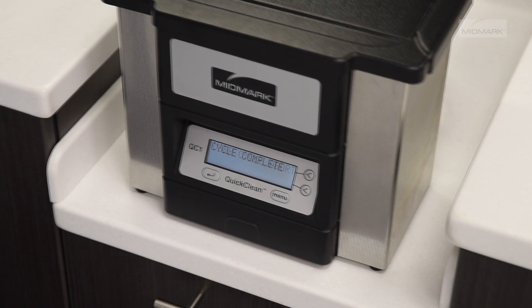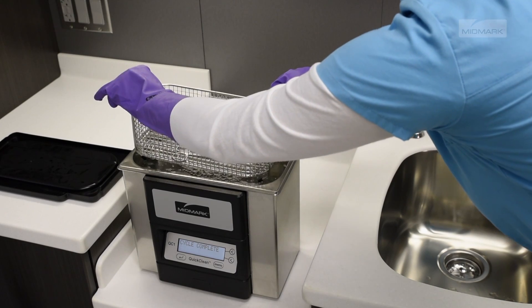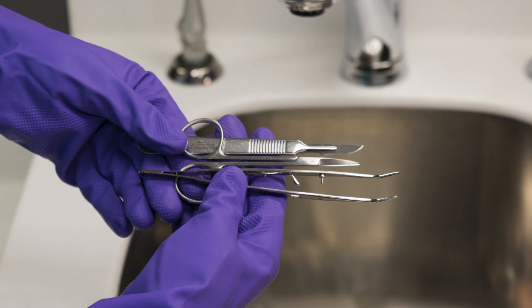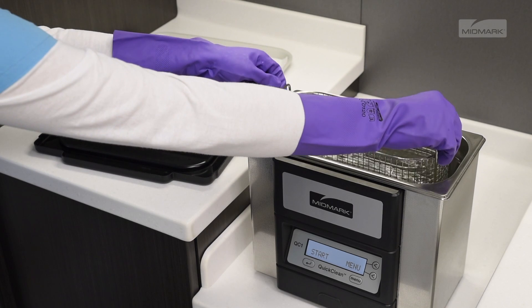Upon successful completion of a cycle, the following message will be displayed until the operator presses continue. Remove the basket from the tank and rinse your instruments with clean water. Be sure to inspect the instruments after cleaning. Should you detect any debris remaining on the instruments, place them back in the ultrasonic cleaner and run another cycle.